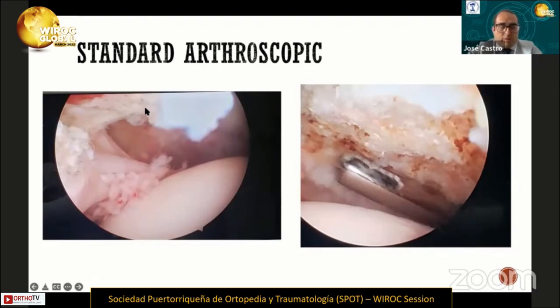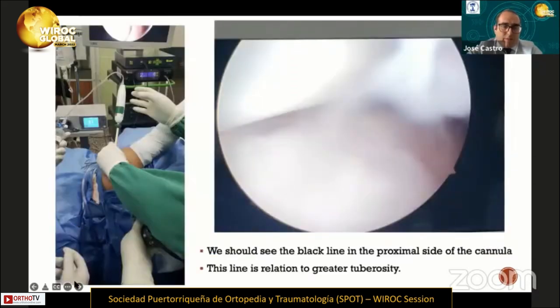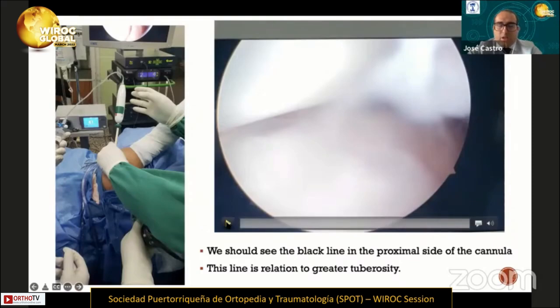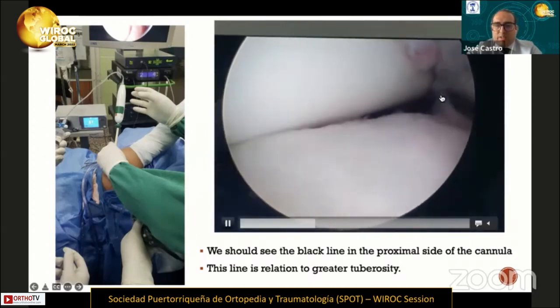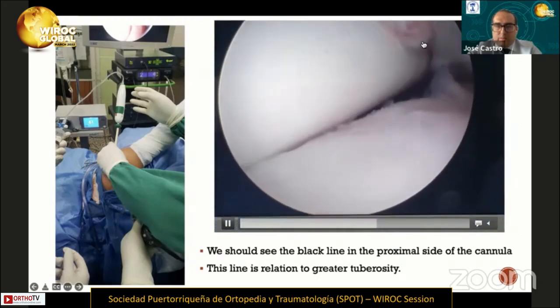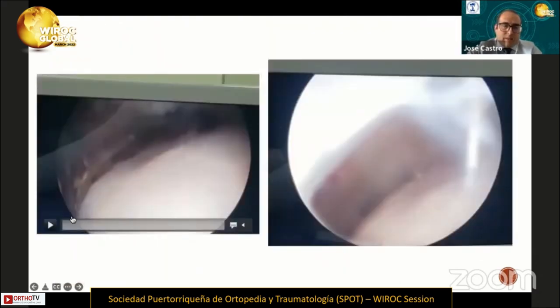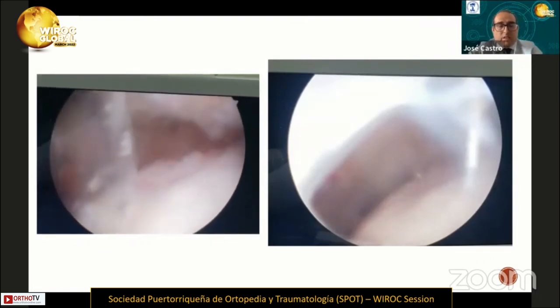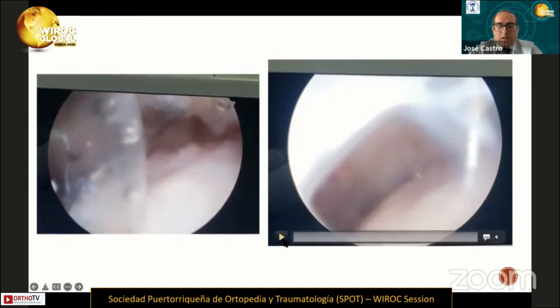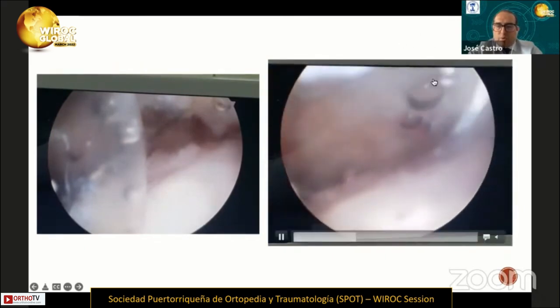We found no remaining rotator cuff tissue. After that, we performed subacromial debridement. This is the setup of the balloon. We started to implant the balloon; the cannula entered the shoulder and we should see the black line indicating the proximal side of the cannula, which is in relation to the greater tuberosity. The balloon was then insufflated with 25 mL of normal saline, and this is the final result of the balloon — we created a new space between the acromion and the humeral head.